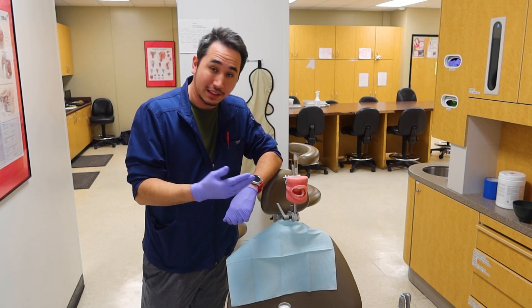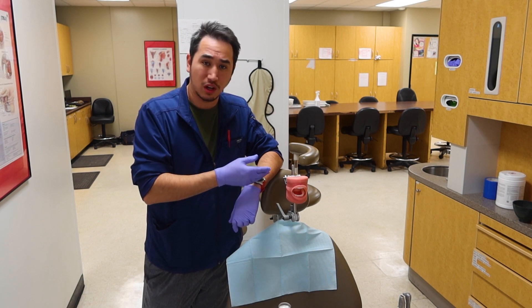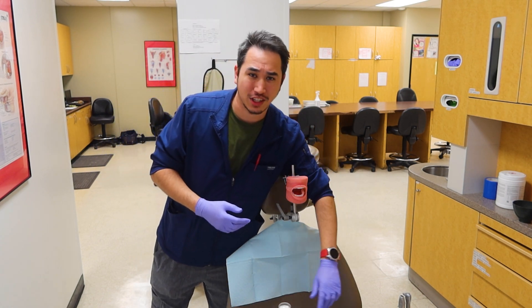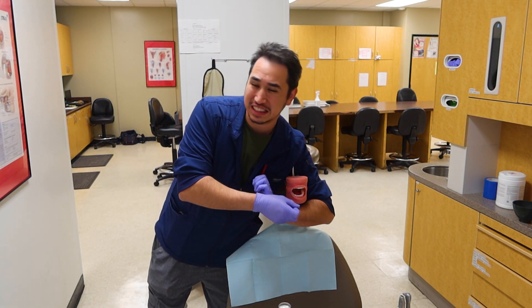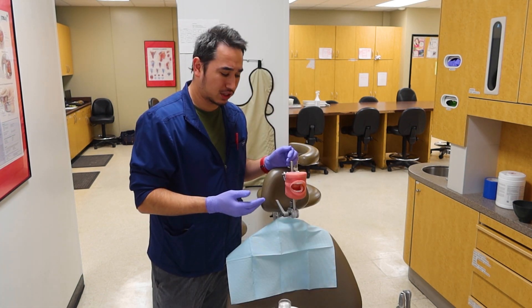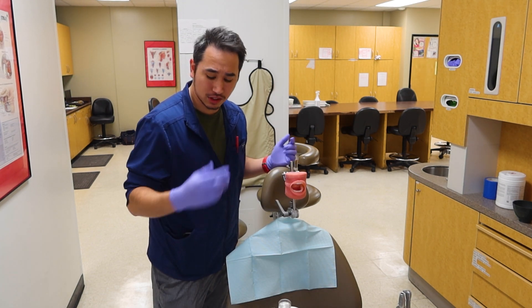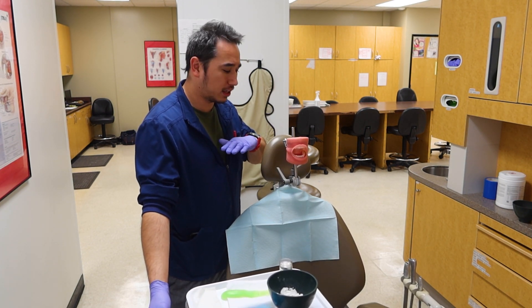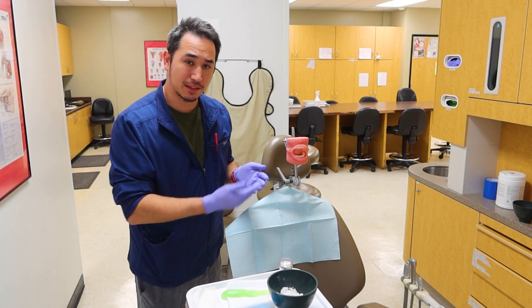When getting your patient ready, make sure you have them at the proper height and level. Just like other assistants, we like to get right up behind our patient in a chokehold-like manner to make sure we get our good impression — it just feels better to come from the rear. Get the patient positioned so their mouth lines up with the center of your chest or where your sternum is. Let's lift them up to the right height — right about here feels comfortable. Now we can go into the next sequence, which is actually mixing and taking the impression.